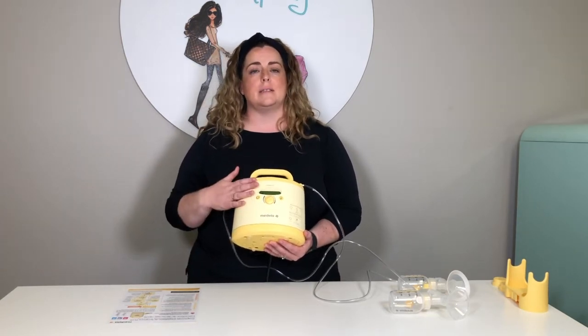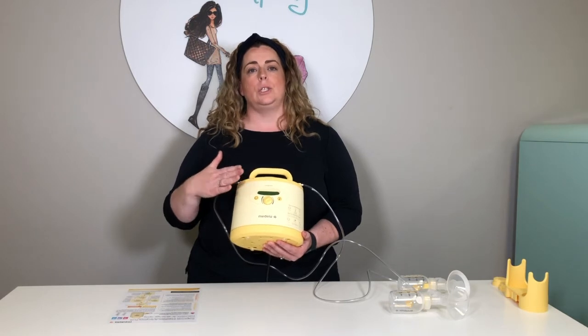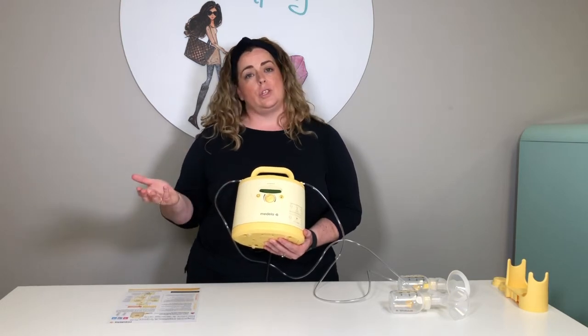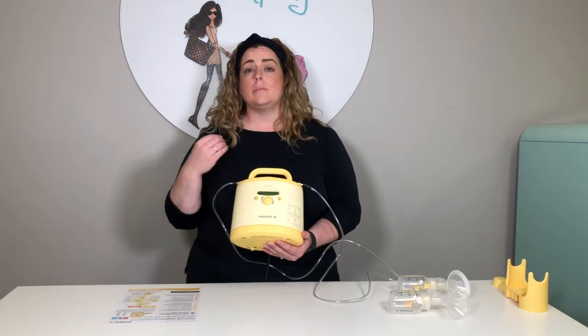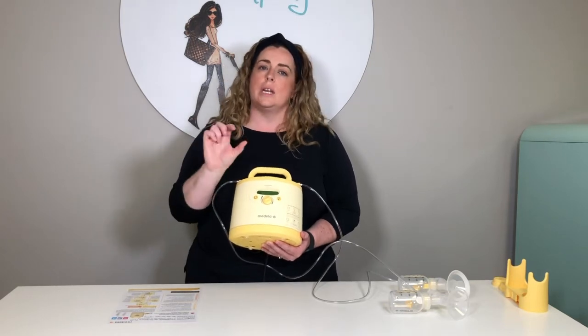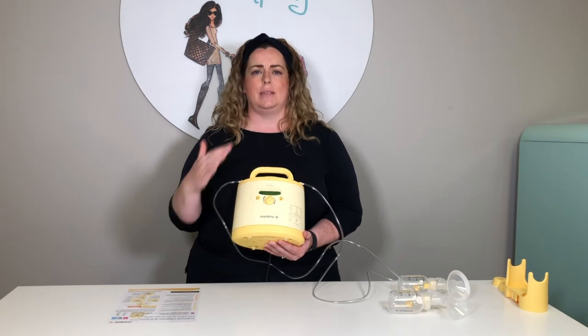And the reason that it doesn't start where you last left off is because you want to adjust the suction level for each pumping session. Why do you do that? Well, because your supply is going to be different from 6 in the morning to 6 in the evening, which also means your tiredness levels are going to be impacted. So you're going to find that suction levels need to be adjusted. No two pumping sessions are ever the same.